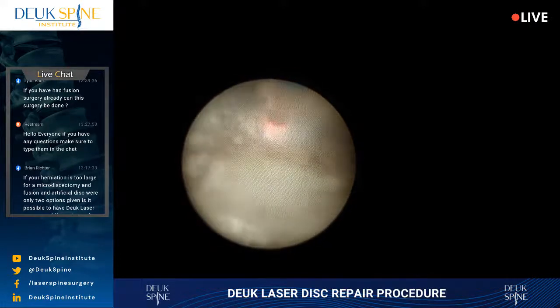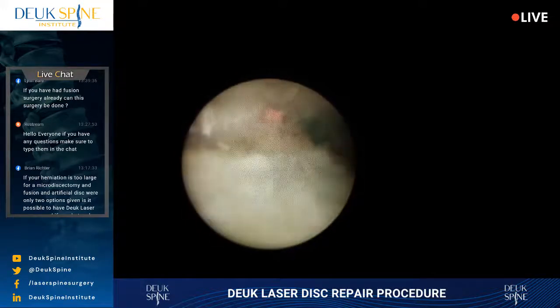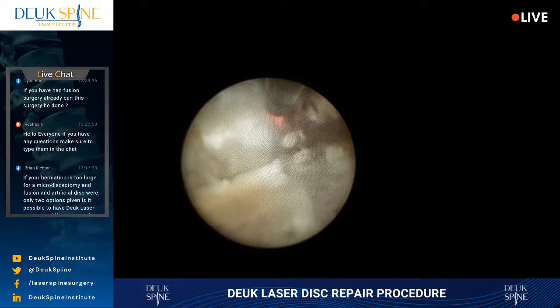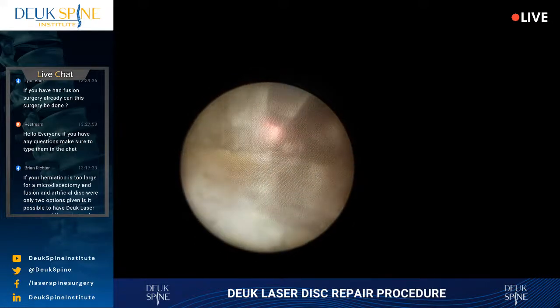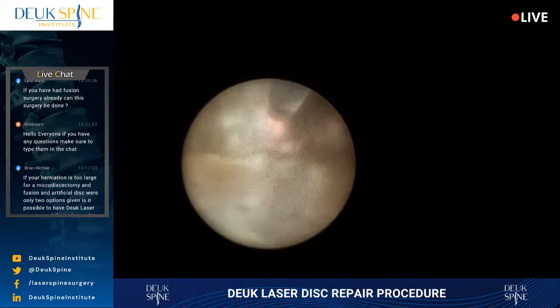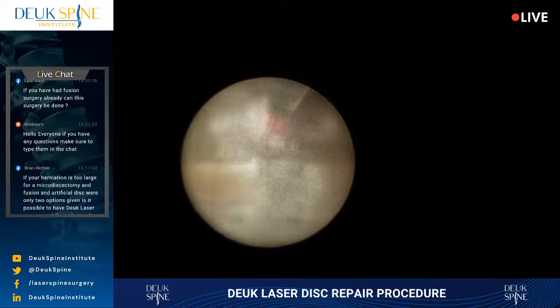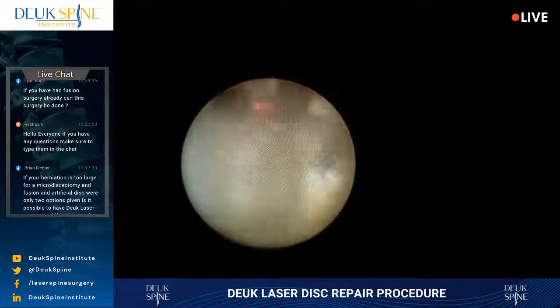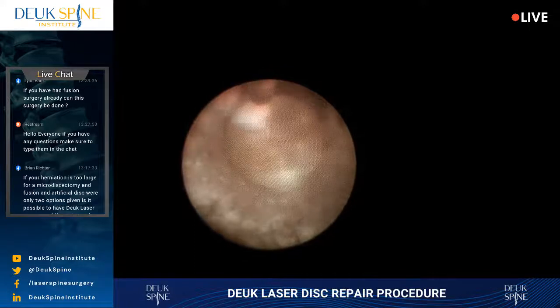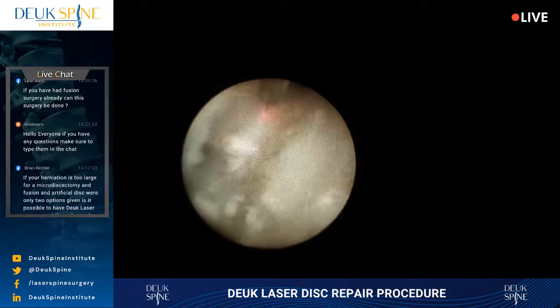And now I'm passing through the PLL with the laser, and I'm looking. I'm trying to figure out, I want to look south. Trying to figure out if we have any herniation down there. Let's see. Uh-huh.